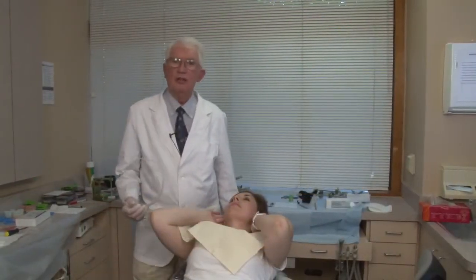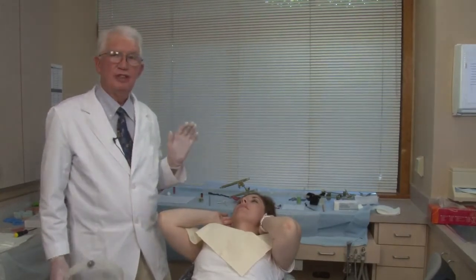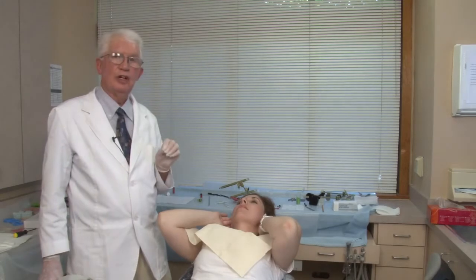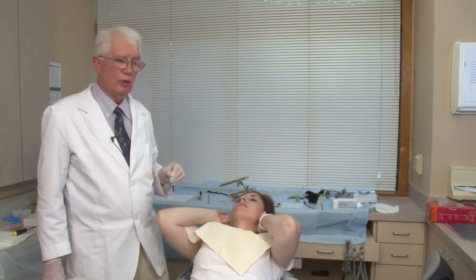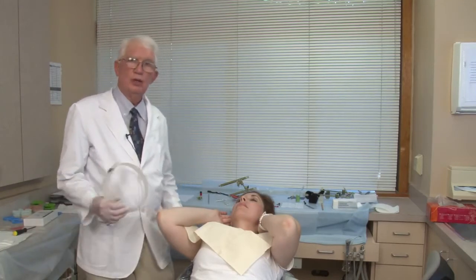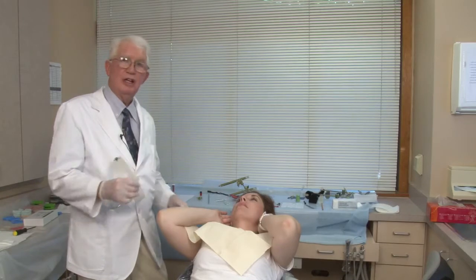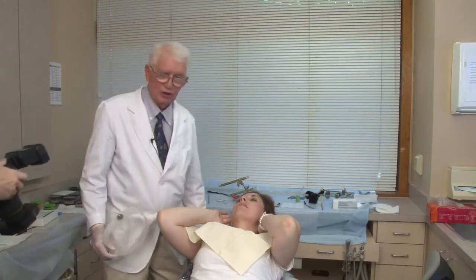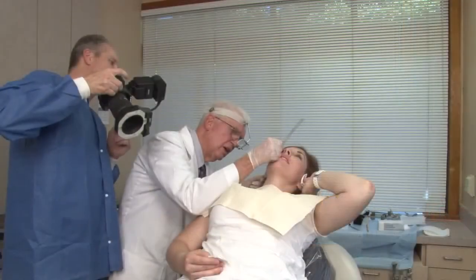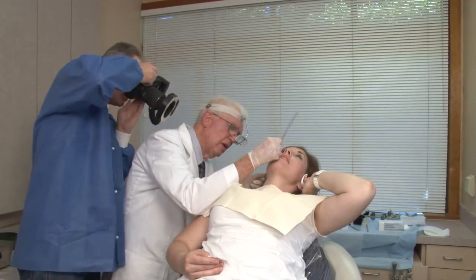About a year from now, if you start looking for that tattoo, you will have difficulty trying to find it. And so if you know exactly where to look, then you'll be able to find it easier. And to know where to look, we use a millimeter rule, place it in relationship to the tragus, and take a picture of the millimeter rule and the dot in relationship to the tragus. Yeah, it's almost right on it.